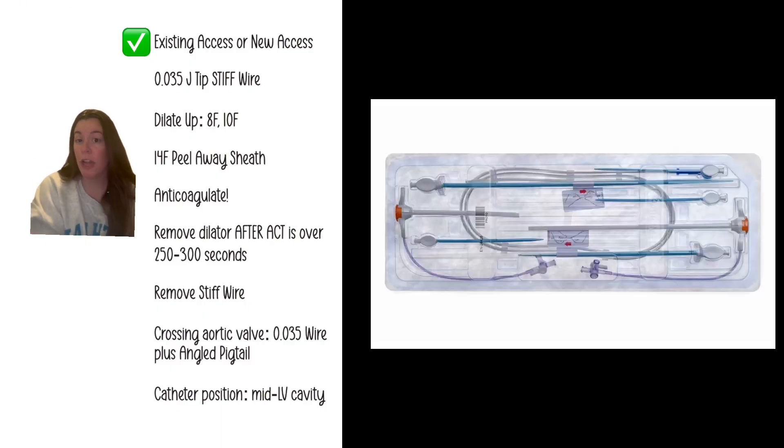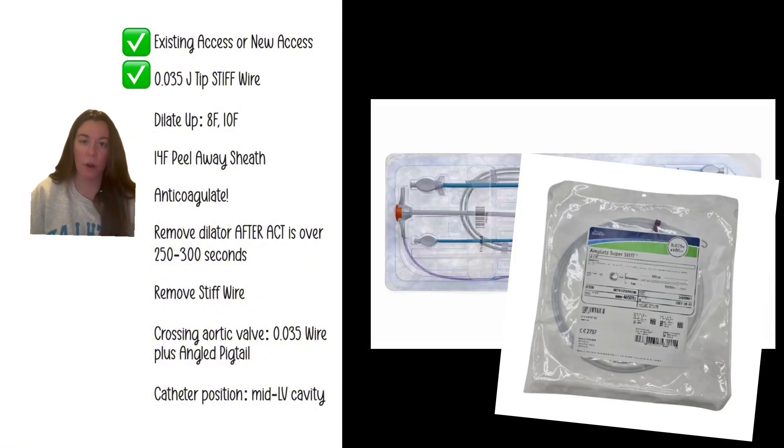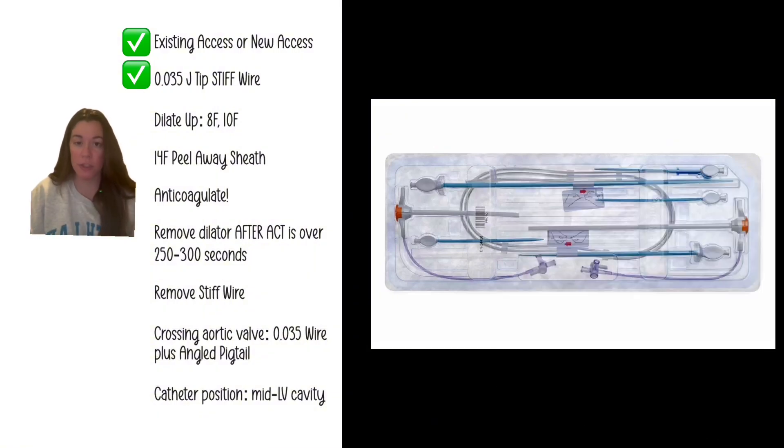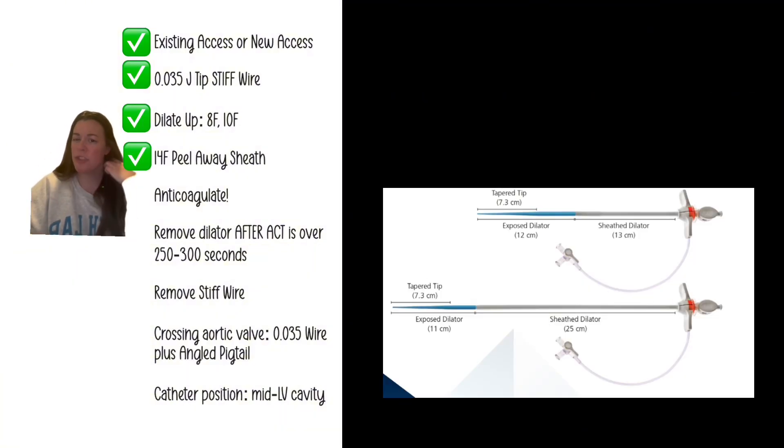Have the circulator open the access kit first, because if we can't get access there's no point in setting up the pump. There's an 0.035 J-tip stiff wire in it; if you lose it you can use an Amplatz wire as a substitute. There are dilators in there — 8 French and 10 French. You're going to dilate up: remove your 6 French, insert the 8 French dilator, insert the 10 French dilator, then insert the 14 French peel-away sheath.